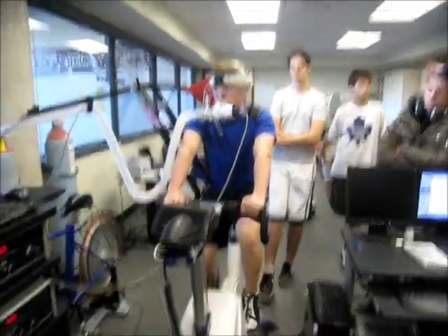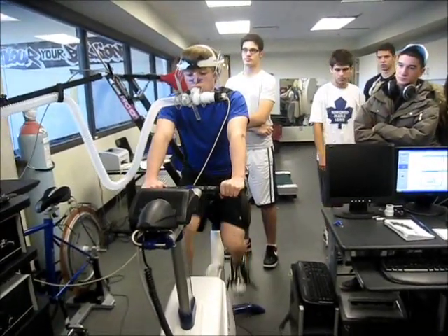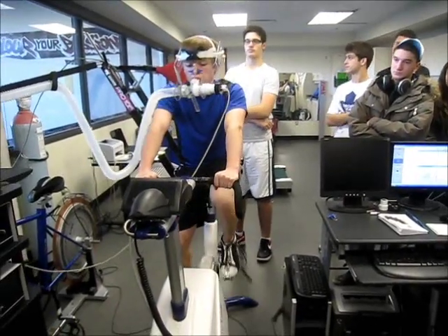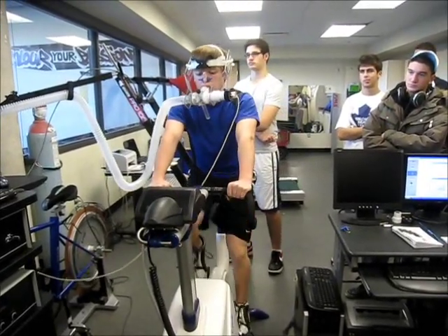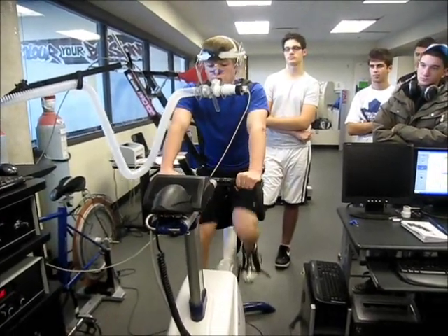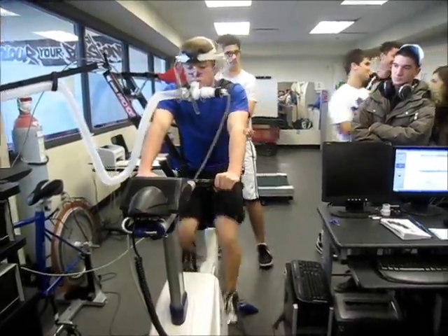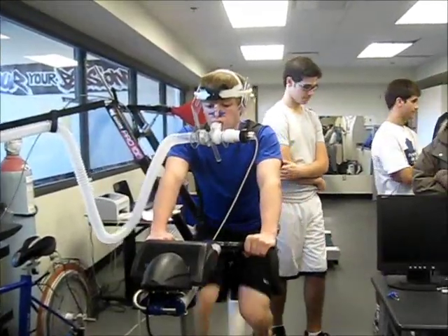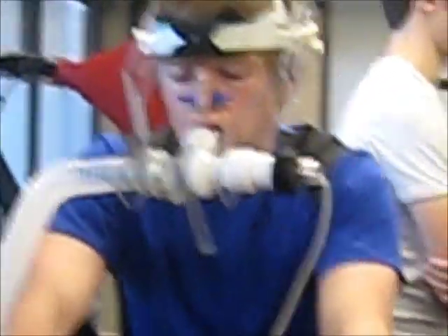For you guys your predicted maximum heart rate would be around 202 to 204. So just over 200. So say he was to give up right now and say he's at his VO2 max — well, let's look at his heart rate. If it's only like 150, maybe he wasn't really at his maximum. It kind of gives us another indication. If he really was at his maximum, we'd expect his heart rate to get to around 200, but there's a lot of variability — it's usually plus or minus 10 BPM. So his age-max heart rate could be 213 or it could be 193.